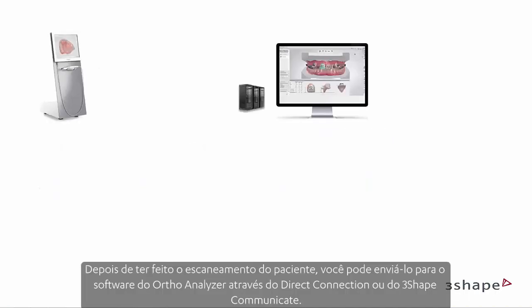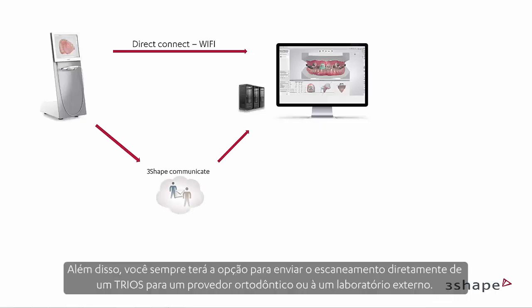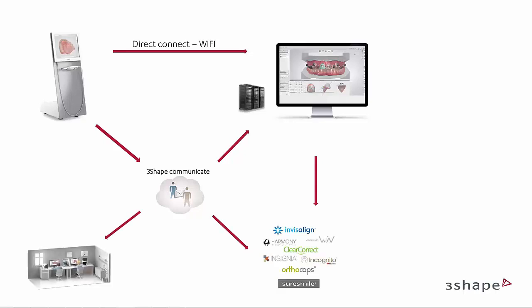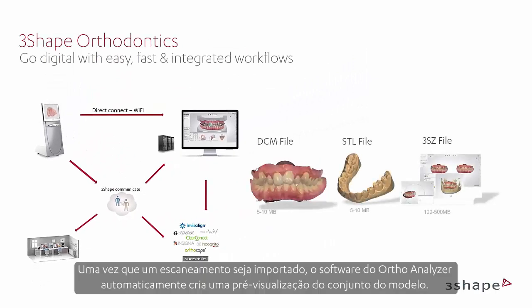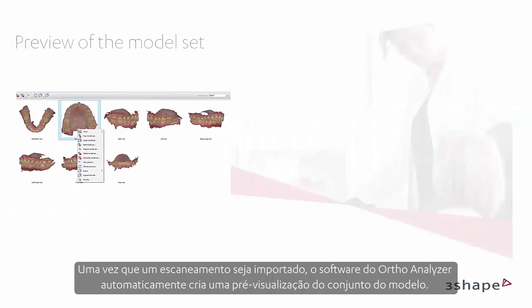After you have made the scan of the patient, you can send it to the OrthoAnalyser software via either a direct connection or 3-shape Communicate. Furthermore, you will always have the option to send the scan directly from a Trios to an orthodontic provider or to an external lab. Once a scan is imported, the OrthoAnalyser software automatically creates a preview of the model set.